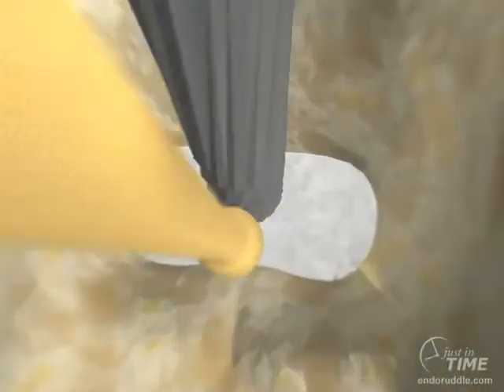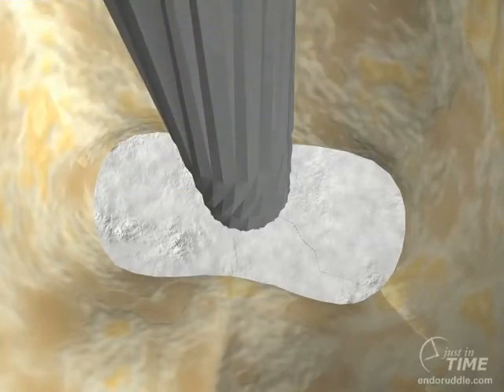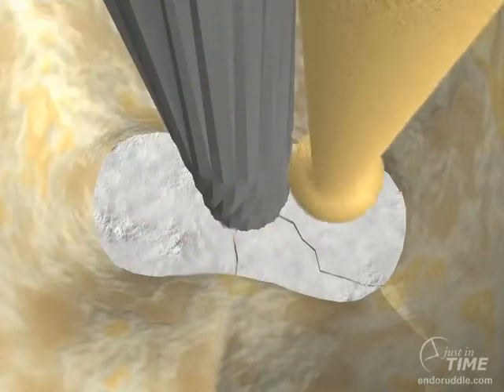Vibrate the post up and down its exposed length, and once you begin to see some checking and crack marks coming off from the post, you're really starting to undermine the post retention — that's the luting agent, or the cement.